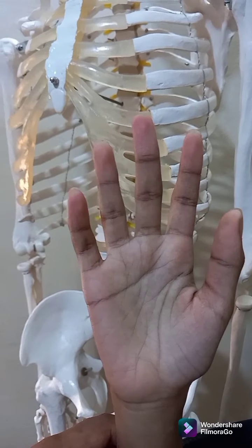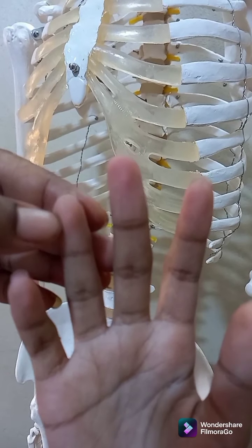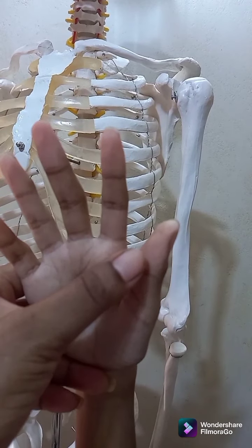It must be on the palm-up surface of the distal segment of the middle or ring finger, and it should be made perpendicular or across the fingerprints, not parallel to it. Capillary sampling should not be performed in the smallest finger because tissue depth is insufficient to prevent bone injury, or on the thumb or index finger because they are more sensitive than the others.